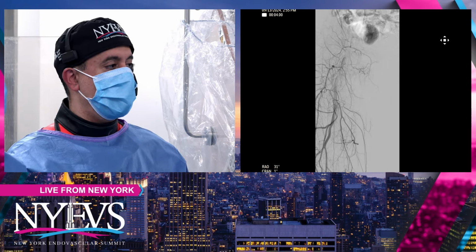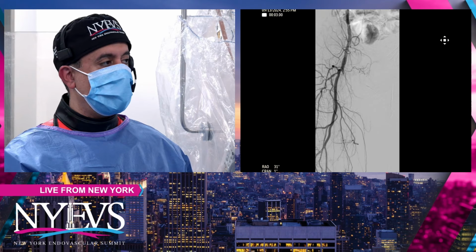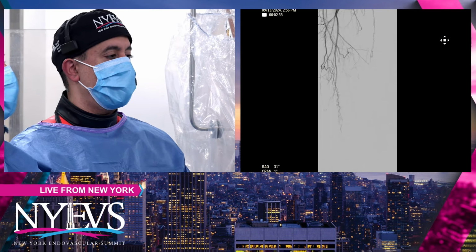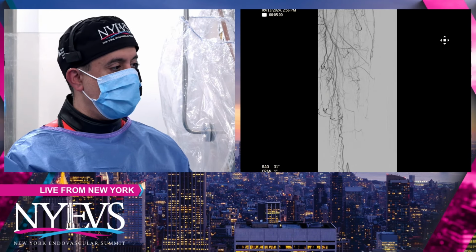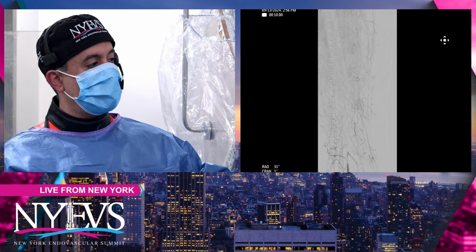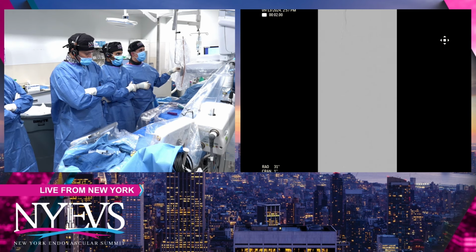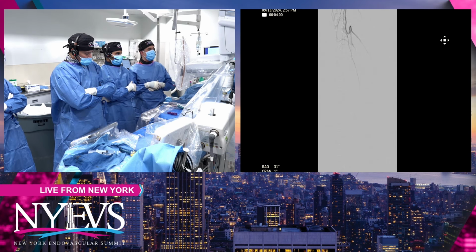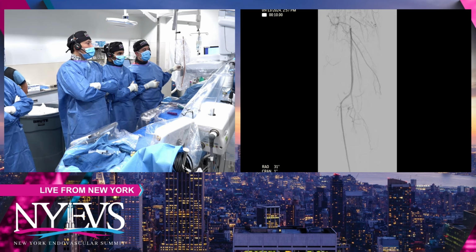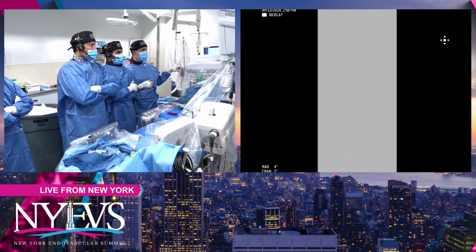You can see the angiogram right here, a robust profunda, but the SFA is occluded right at the ostium, just at what we call the edge in-stent restenosis. It reconstitutes distally right at the popliteal segment, almost like the P1 into P2 segment, which is after the end of the stent. So there is some de novo lesion as well, or new atherosclerotic lesion after the stent. For below the knee vessel runout, the patient has a robust anterior tibial and peroneal. The PT is occluded. So essentially one and a half vessel runout. We're going to see some disease in the peroneal, but the AT is nice, which is supplying the foot. And this is a picture of the feet.